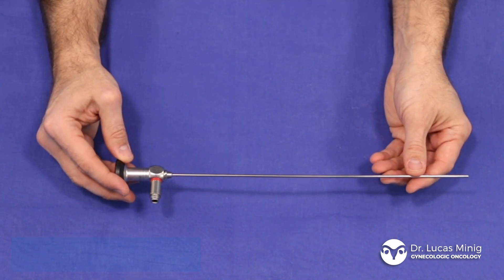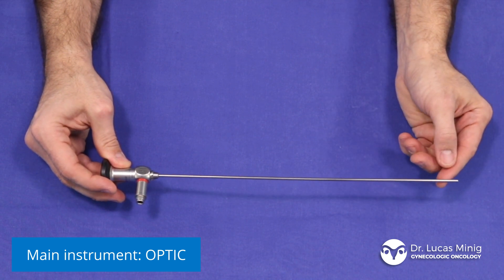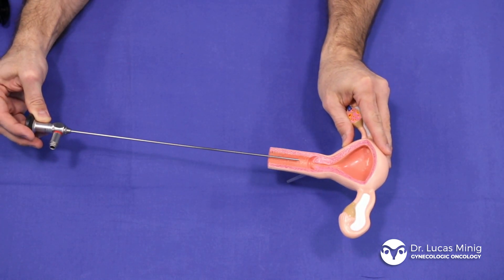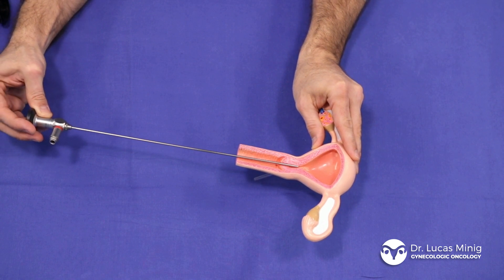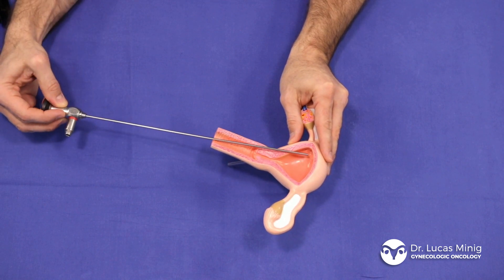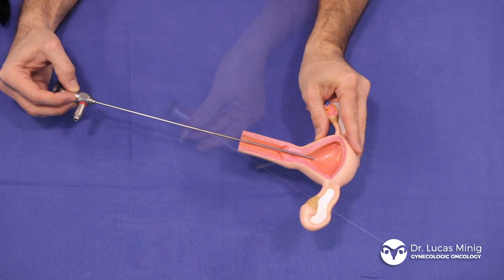Hysteroscopy is performed with the main instrument called the optic, which is the instrument you see here. It is between three to five millimeters in diameter and about 20 to 30 centimeters in length. This optic allows us to enter through the vagina, then through the cervix, and finally access the endometrial cavity, where we can see the entire surface and diagnose under direct visualization any type of pathology present in the uterine cavity.